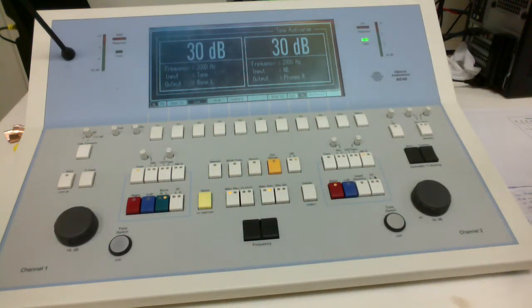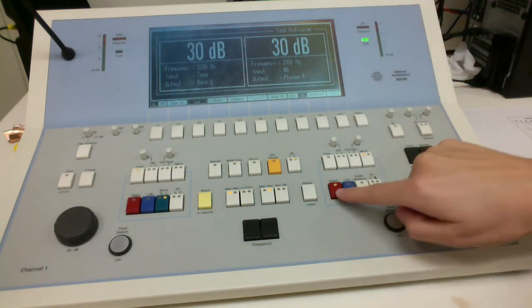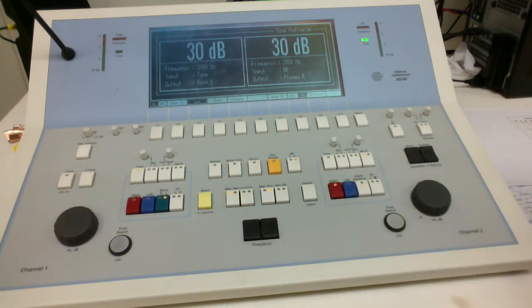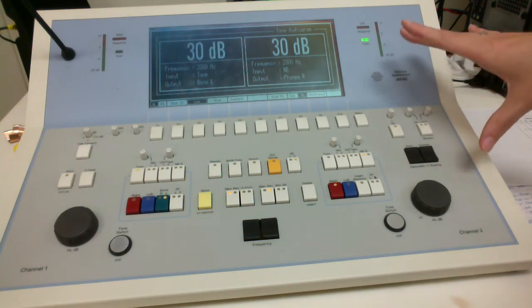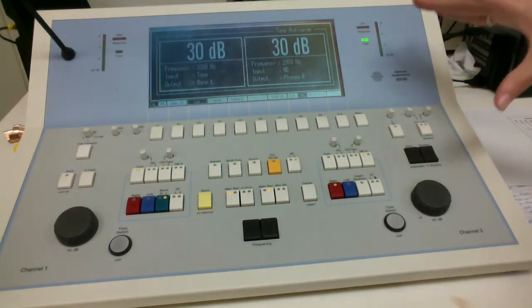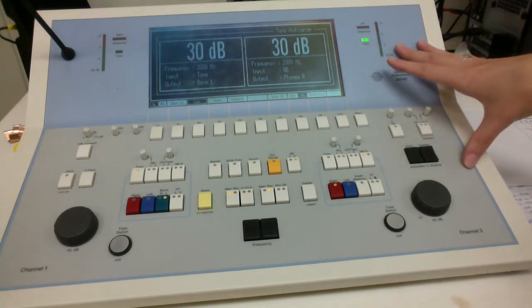And the masking noise, we'll still be using air conduction, and we'll still be using supraoral headphones, since that's what we were previously using. So it should be phones right, which we clicked there. If we wanted to change it to phones left, we could click there, but we're just going to keep it on phones right. You can check out the slides that I have posted on Blackboard for how you place both the supraoral and the bone conductor at the same time. It's not exactly intuitive. I'll also be going over it in class.